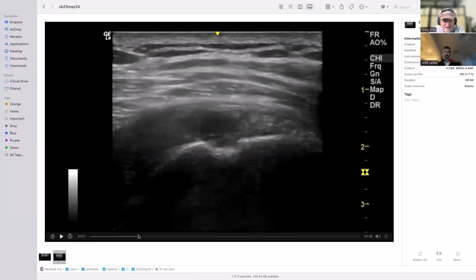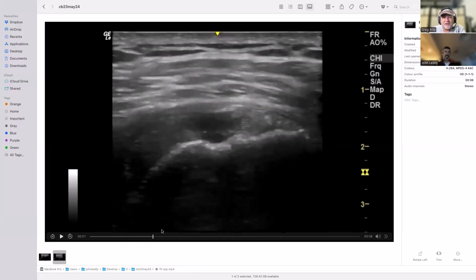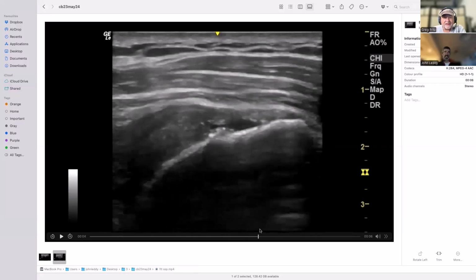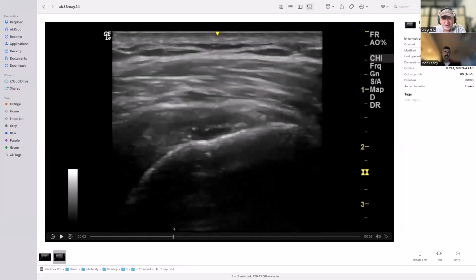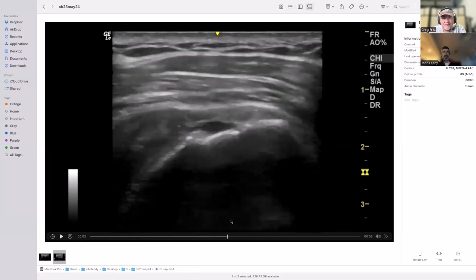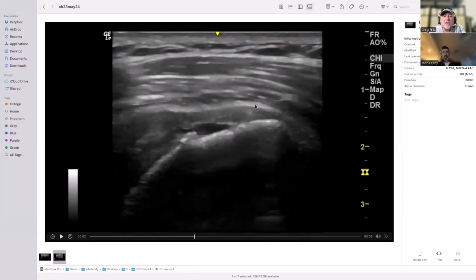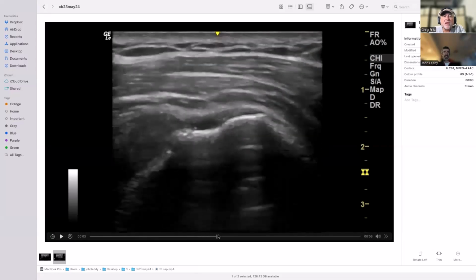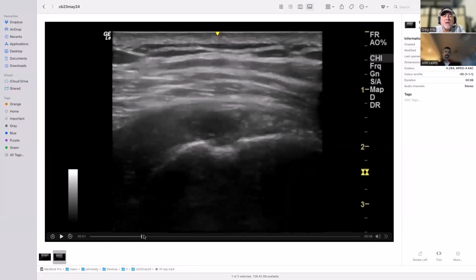So we can pan through that. Those are essentially short axis fibers of infraspinatus. And this is the defect in supraspinatus. More than just showing a lesion within the supraspinatus, that helps to better identify the trajectory of infraspinatus and supraspinatus. So you can see the infraspinatus fibers just running out of juice there. They're finishing inserting there. And you come back and you can see the breakdown of the supraspinatus elements and possibly a little bit of a tear into the infraspinatus.